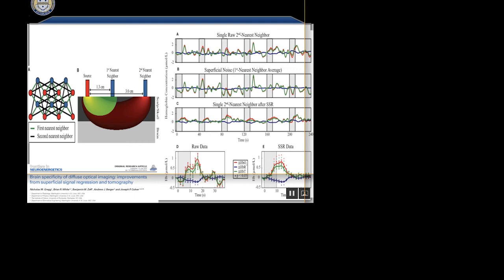So we would need to prototype something for the other grommets, really, not surface support. The other thing that reduces the signal is this is a super inefficient way to couple, but that's a good thing. You don't want too much signal. Normally you would never do this and expect to get good signal. You're losing at least half the signal just doing that, but it's not a big deal because it's so close.